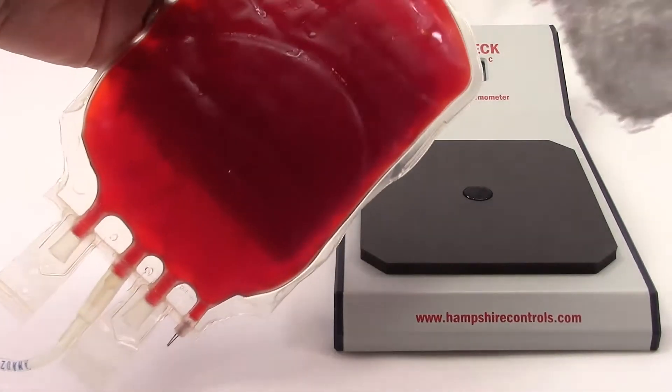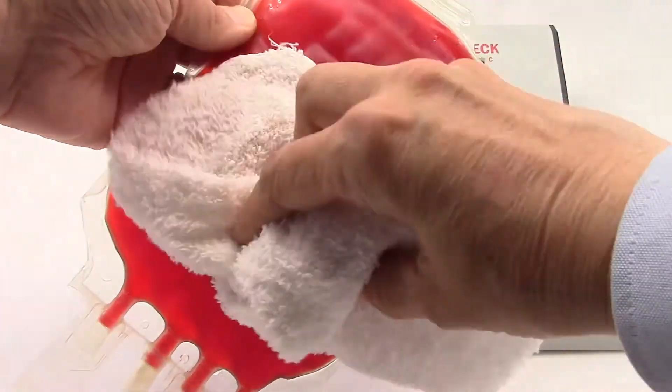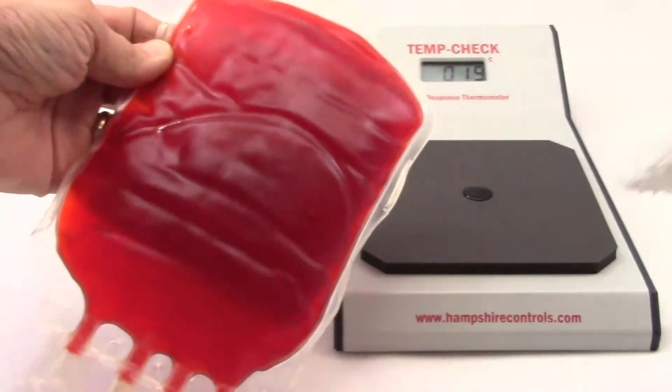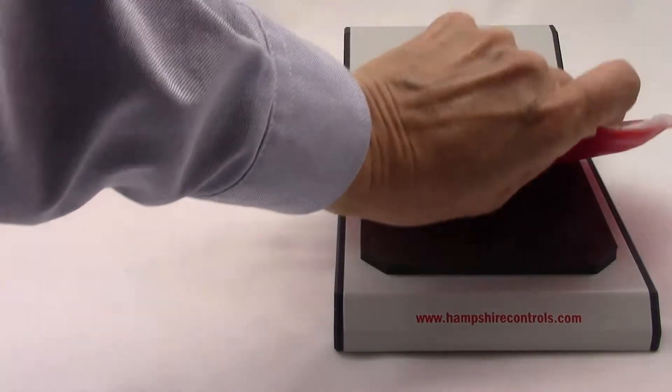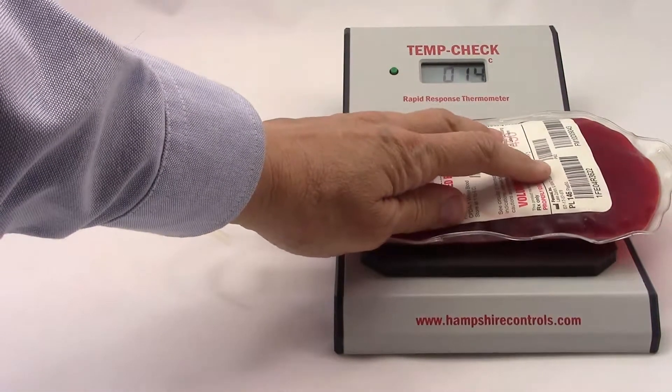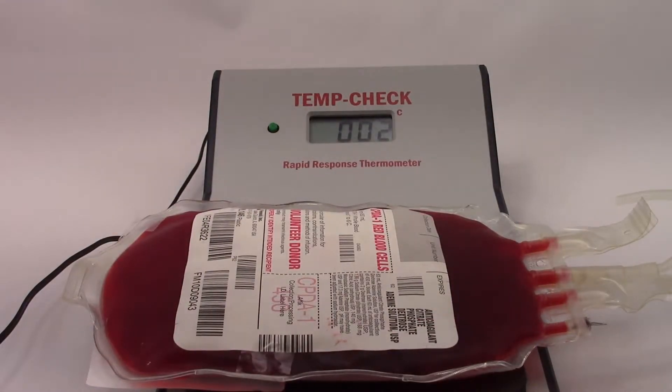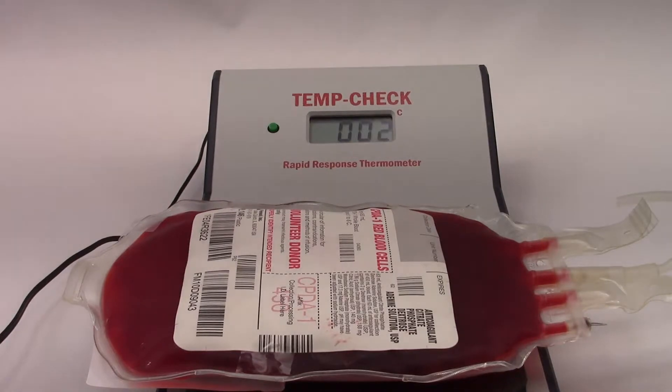When dealing specifically with bags filled with plasma, remove all water droplets from the part of the bag that comes in contact with the TempCheck sensing pad, because external water will act as an insulator and may give false readings. Bags of plasma taken from a microwave plasma defroster can be placed directly on the TempCheck sensing pad.